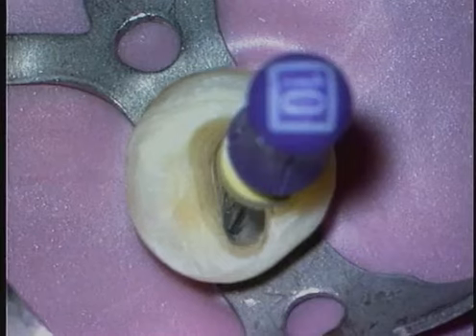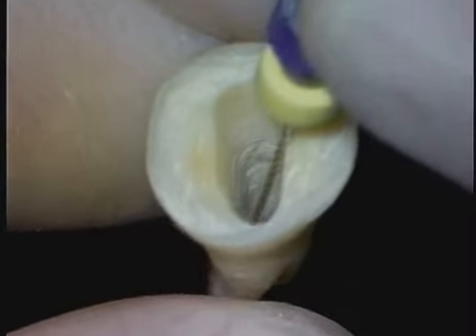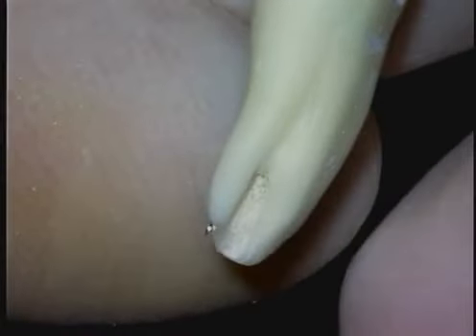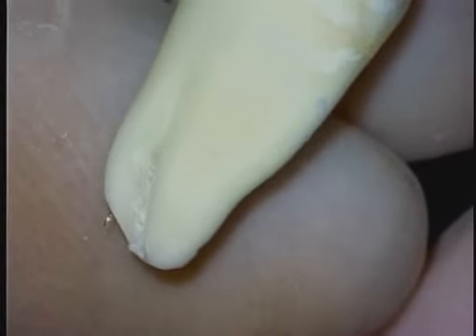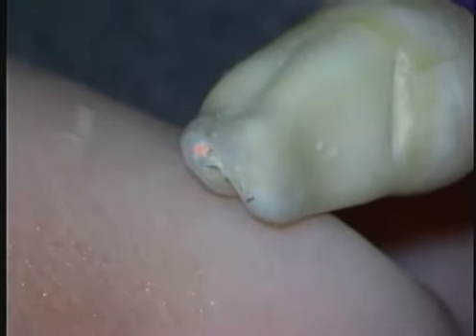Now working the instruments to length can be pretty revealing, because looking at the extracted tooth you can begin to see the broad root. You can see that it's a fused root, the apical third has a cul-de-sac furcation, and the system that we just negotiated has its own separate apical portals of exit. You can see the gutta percha on the more facial aspect.